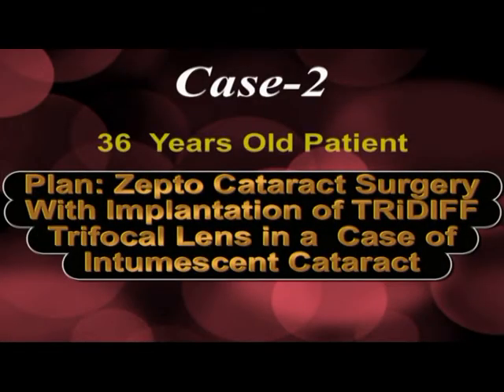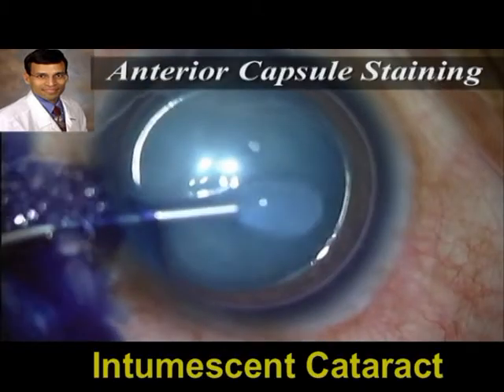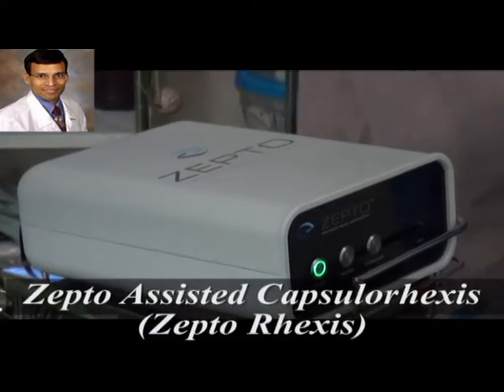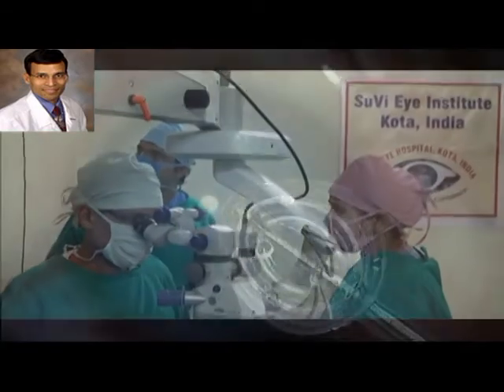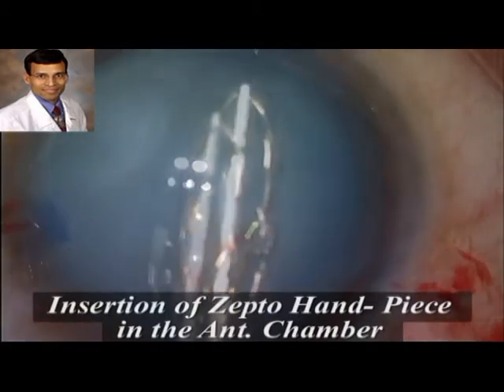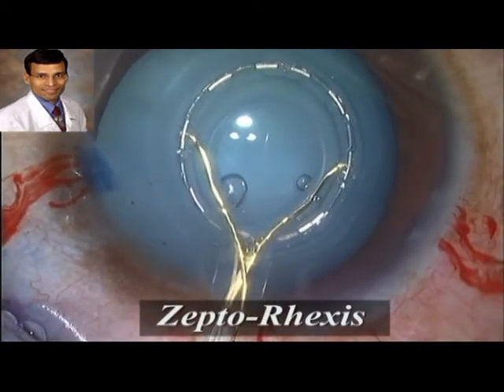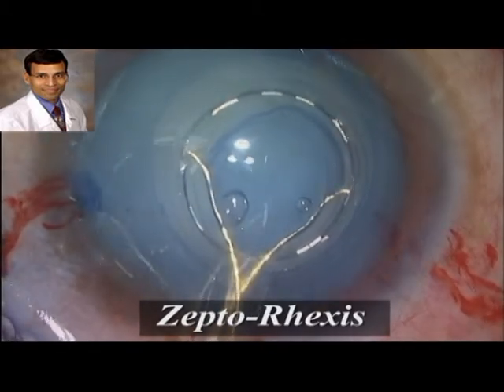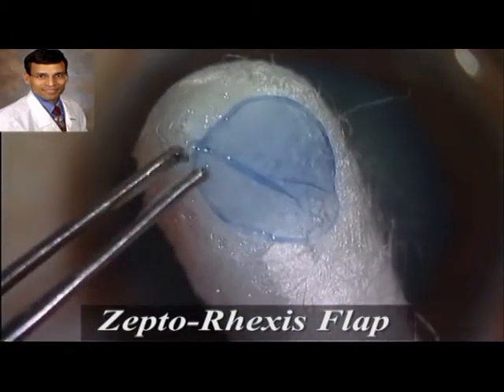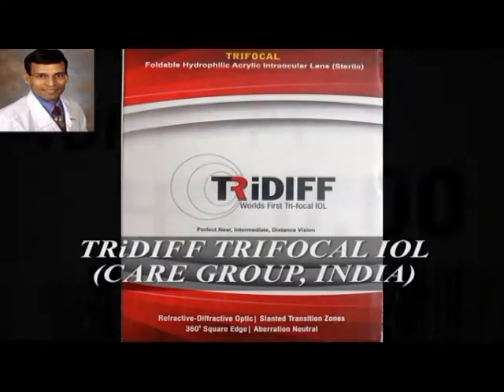The second case is a Zepto cataract surgery with implantation of a tri-diff trifocal IOL in an intumescent white cataract. A sideport incision is made and the anterior capsule is stained. The Zepto handpiece can be inserted through a 2.2 mm incision or through the main cataract incision. The silicone suction cup with the nitinol ring is well-positioned and centered under direct microscope visualization, vacuum and nanopulse technology are applied, and a smooth rexis is achieved in one go. As seen here, the margins of this rexis are extremely smooth, circular, and uniform, achieving 360-degree overlap on the IOL optic, which is important for the correct effective lens position.